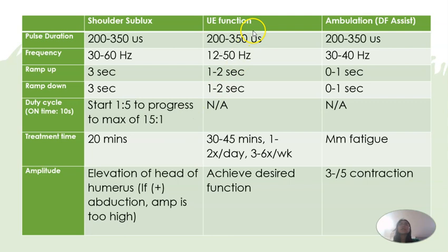For the upper extremity function naman, yan, as is. The intervention here may need to last longer than 4 weeks for an effect, para ma-observe natin yung effectivity ng treatment. So, ibig sabihin, kakailanganin ni patient ng more than a month of sessions with you. And then for ambulation naman, again, this is used for foot clearance. So, yun ang focus natin when we use FES for ambulation.